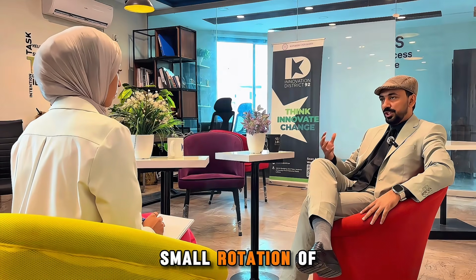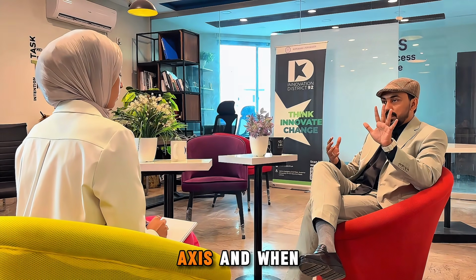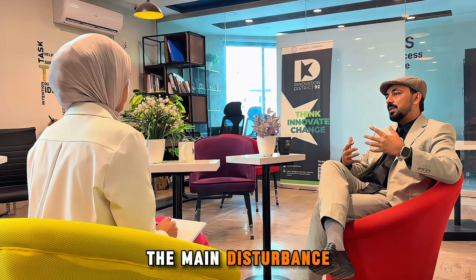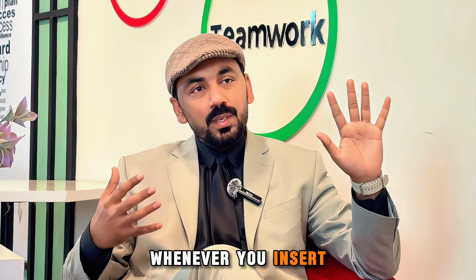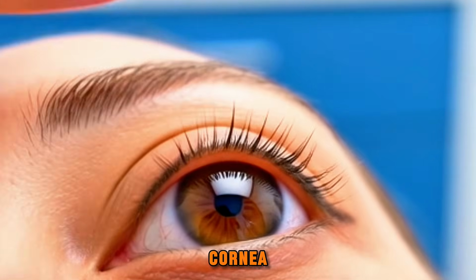As I said earlier, Ms. Kashmala, even a small rotation of a toric contact lens can cause a rotation in the axis. And when the axis rotates, the whole vision will get blurred, right? The main problem, the main disturbance in toric soft contact lens fitting, is lens rotation. So whenever you insert the toric contact lens on the surface of the patient's cornea, you have to be very careful. Sir, my next question is, what should be checked before fitting the soft toric contact lens?